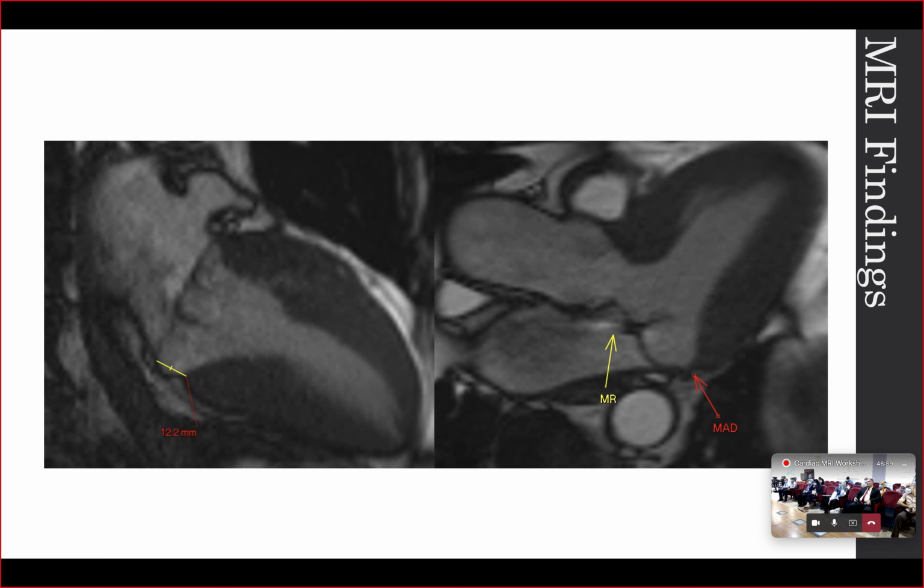And I personally changed my practice, so now I check, and you will be surprised that it is present in many cases. It's frequently encountered in MRI, especially if you have connective tissue disease patients like Marfan syndrome, for example. There is a high percent of those patients having the mitral annular disjunction, and they are not being sent for any surgery for the mitral unless there is a significant regurgitation. Then the discussion will be whether to do something about the regurgitation or not.